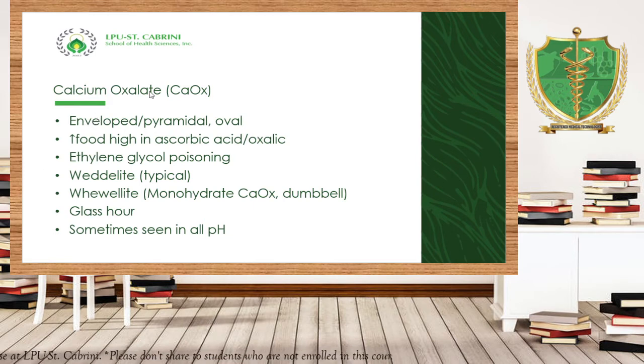And take note, guys, that calcium oxalate is also the most common matrix that involves lithiasis. Ano yung lithiasis? Ito yung mga stones in the kidney. Stone formation or lithiasis formation. Okay? Calcium oxalate will also be seen in patients with ethylene glycol poisoning.